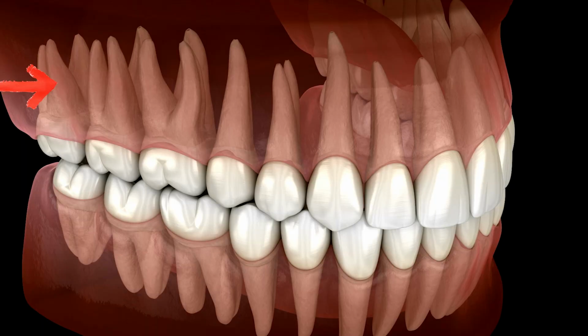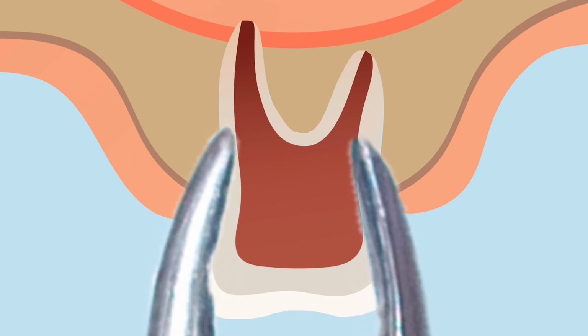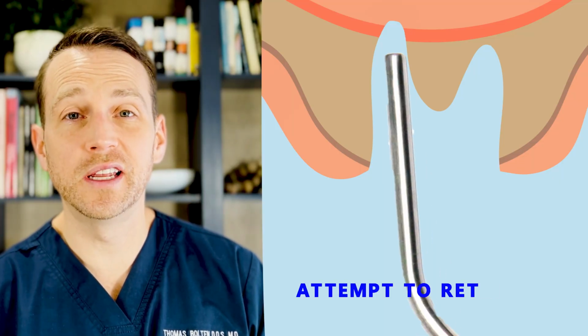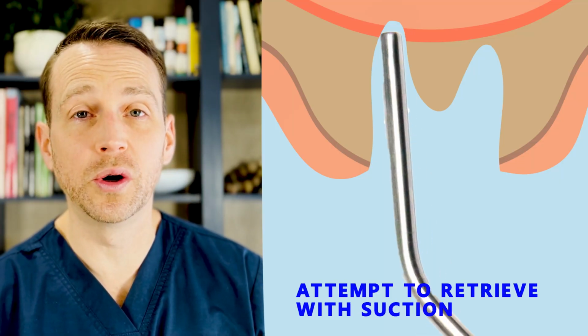Here's the tale of my first root into the maxillary sinus. I was gingerly trying to tease out the mesial-buccal root of tooth number 3. I had about half the root out and the palatal and distal buccal roots came out no problem. The root tip in the mesial-buccal space was holding strong until suddenly it disappeared into a black void. I immediately grabbed the suction and attempted to retrieve the root by placing it over the hole. When this proved unsuccessful, I recalibrated and started to follow the protocol.